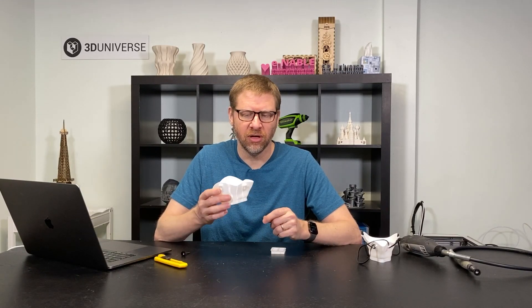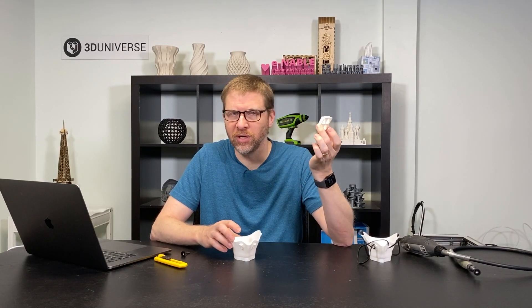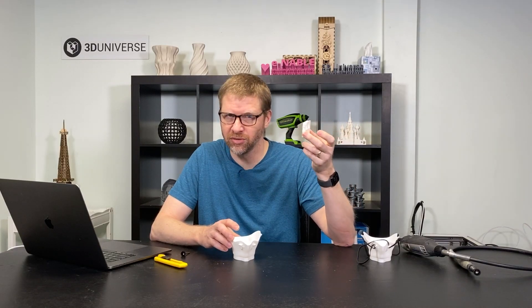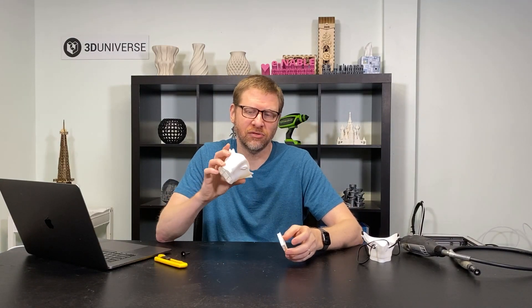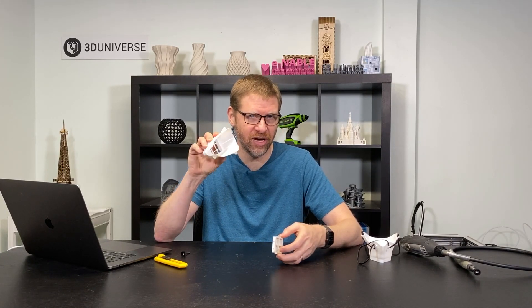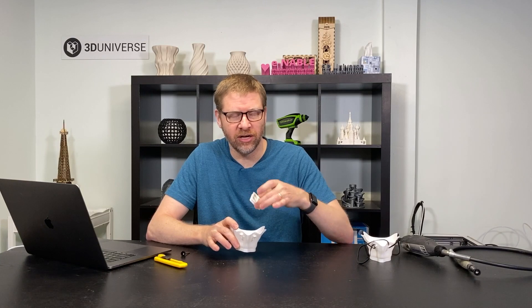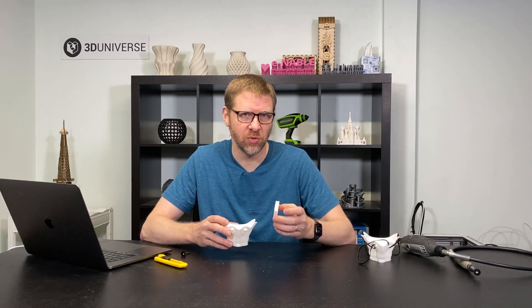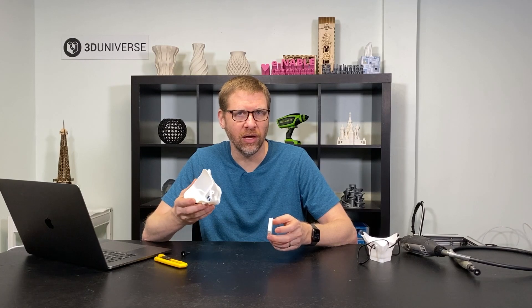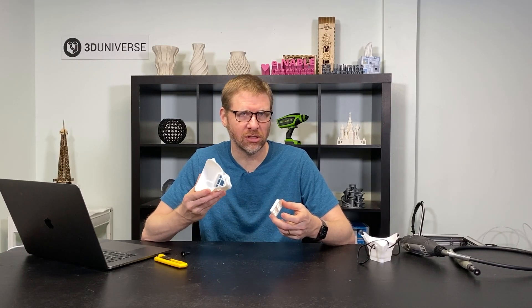The mask body itself needs to be printed in TPU. The filter frame that gets inserted over the filter to hold the filter sheets in place gets printed in a rigid material — you can use PLA, tough PLA, PETG, or pretty much any rigid material. That just needs to be something rigid so that it can hold the filter tightly in place. This design has been optimized for TPU, taking advantage of the fact that this material has some flex. When you insert that filter frame over the filter sheets, you get a really nice tight fit — it causes the inner surfaces of the mask to expand a little to hold the filter sheets tightly. If you tried to print this mask in PLA, you won't even be able to insert the filter frame because it's too tight a fit. Those tolerances were specifically designed for the mask being printed in TPU.